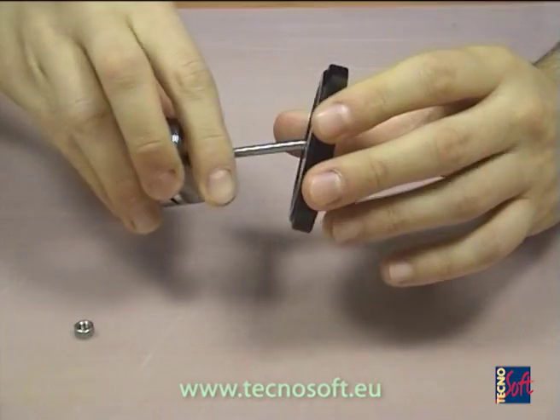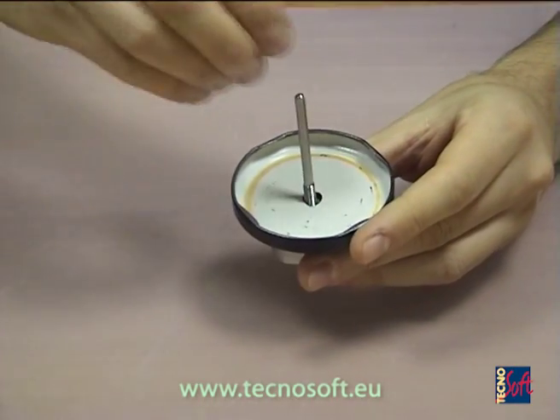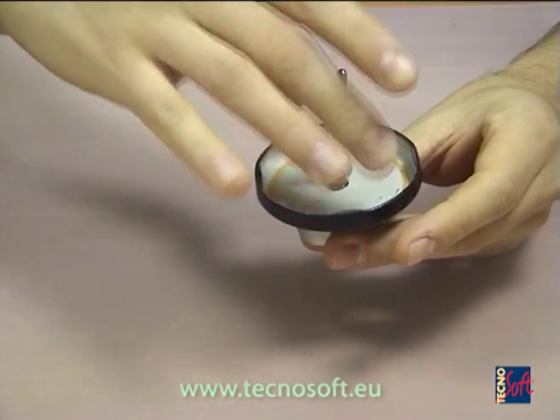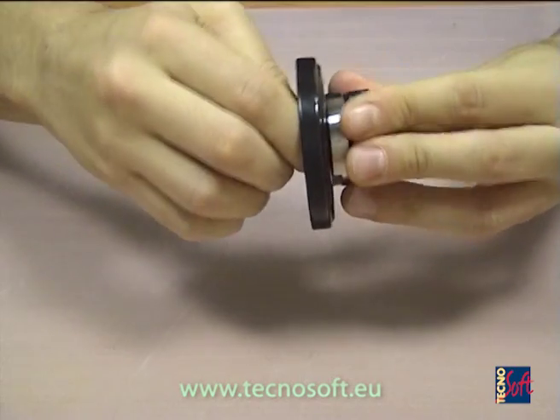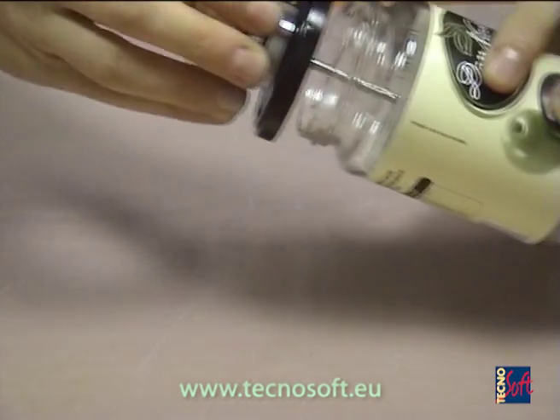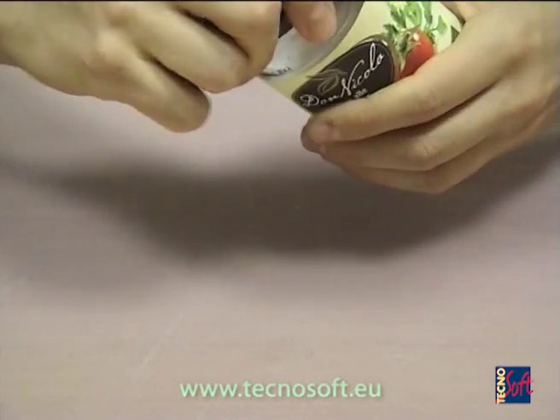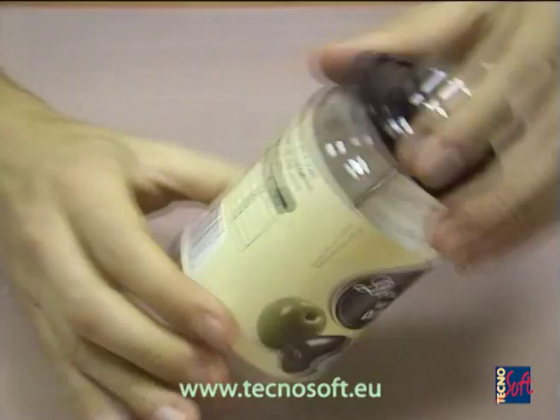Then we screw the counter bolt to fix it to the cap. Of course this solution implies that the length of the probe is exact and correct to reach the cold spot inside the container.